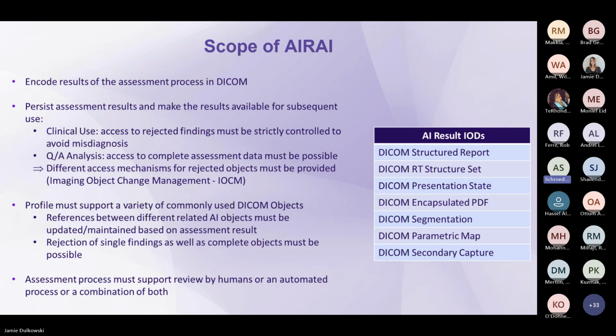The interesting thing there is we have objects which have structured information, like a structured report where you can have very detailed information about each and any nodule, for example, in a lung study with outlines and measurements and so on.